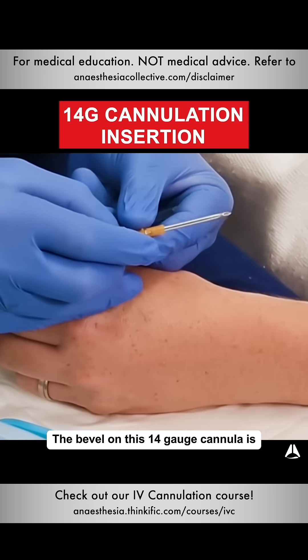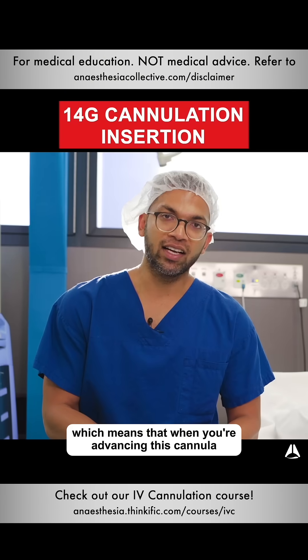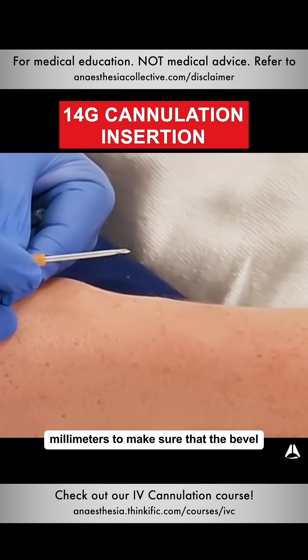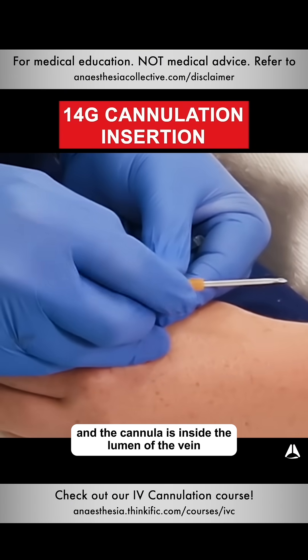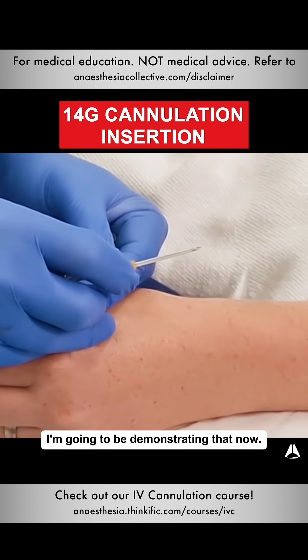The bevel on this 14-gauge cannula is about 7mm, which means that when you're advancing this cannula after flashback, you might need to advance it even up to 10 to 15mm to make sure that the bevel and the cannula is inside the lumen of the vein before you feed it off. That's really important to know, and I'm going to be demonstrating that now.